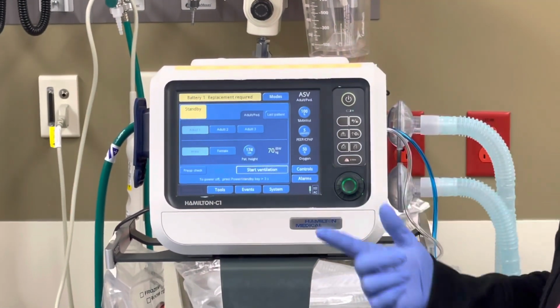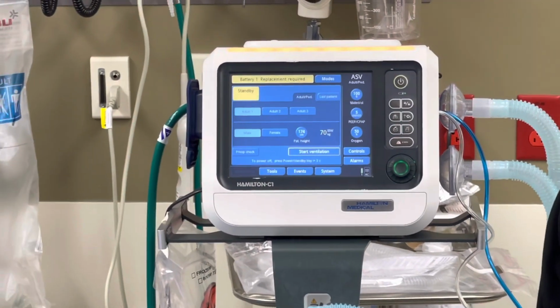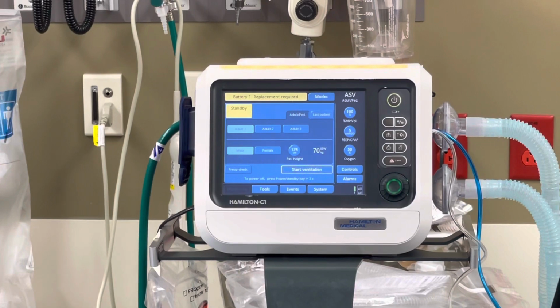And then always give your patient time to respond, because you're gonna make a change and they're not gonna respond right away. It's gonna take just a little bit of time, just kind of let the vent work, let them get some breaths, and then you should start to see the SAT go up, okay?